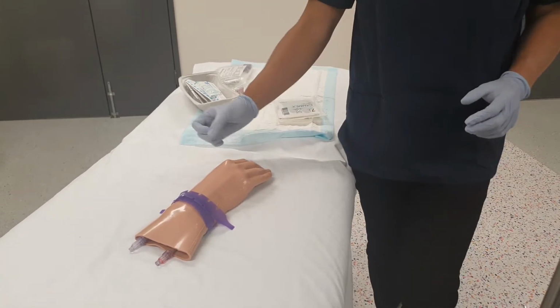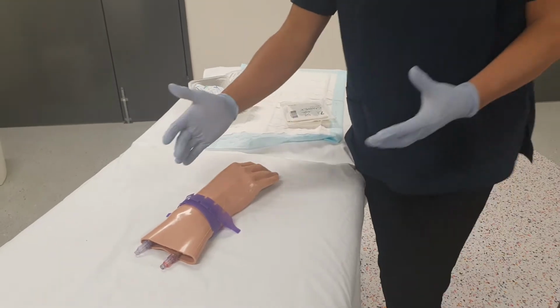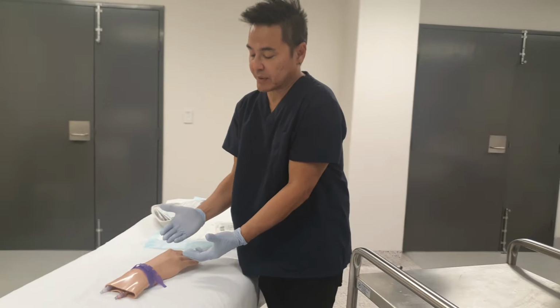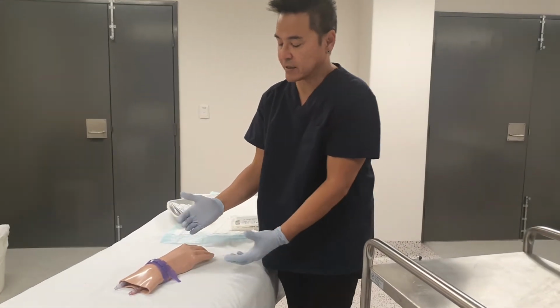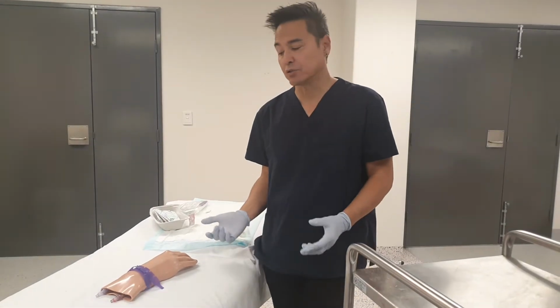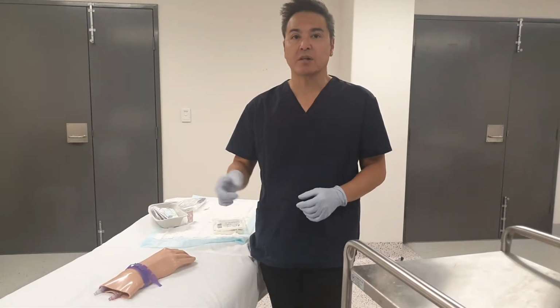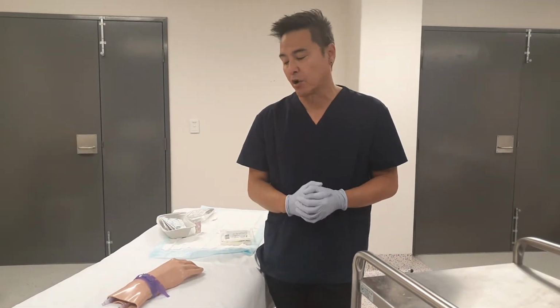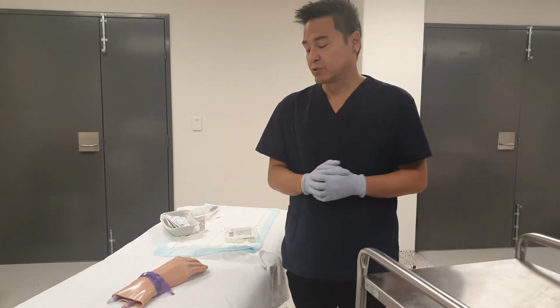The reason why I do like to keep the tourniquet on is that we're waiting for all that arterial blood to turn venous blood and get engorged on the way back, so it's doing its job. There's a lot of handy hints that you can do to engorge the vein as well, like making sure that the patient's well hydrated, even dangling their arm down a little bit low and all that sort of stuff that I'm sure we've gone over.